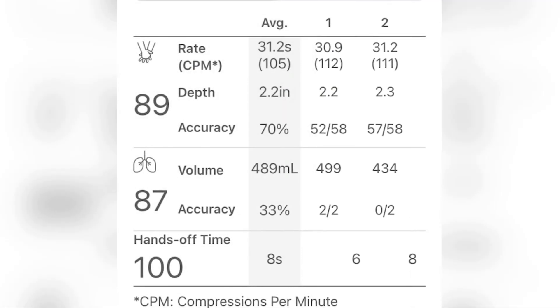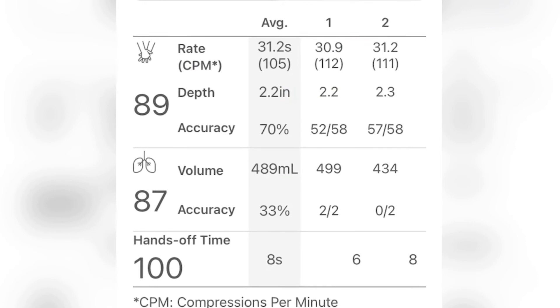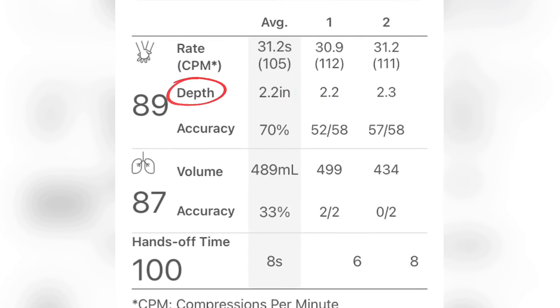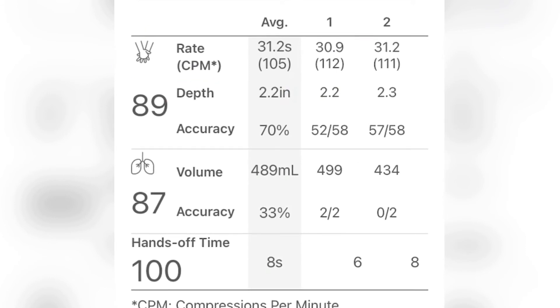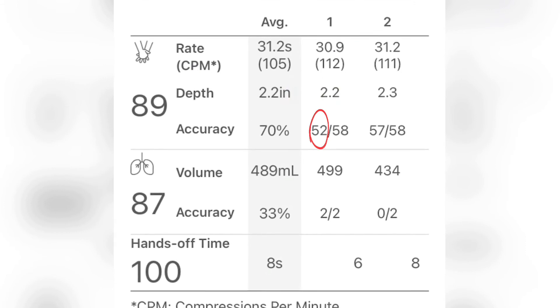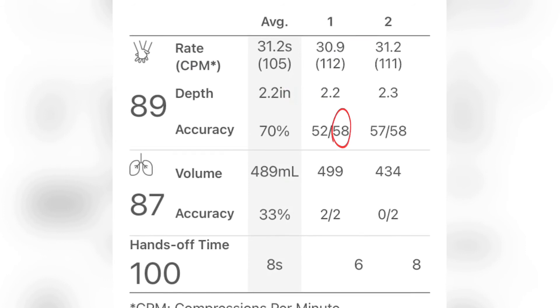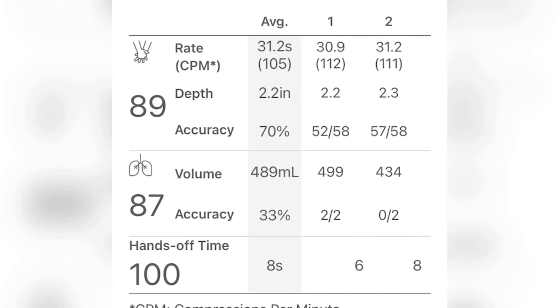First is the compressions category. This data is broken down into the rate, measured in compressions per minute, and the depth. The ratio below the depth shows the number of compressions. The numerator is the number of what is considered to be a good compression in accordance with the applicable guidelines. The denominator shows the total compressions that were performed within that specific cycle.